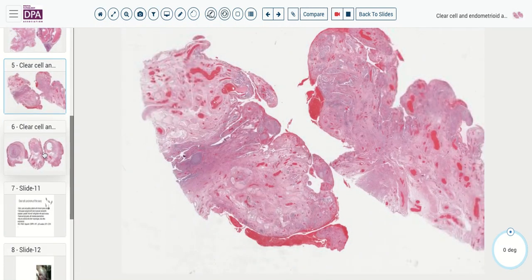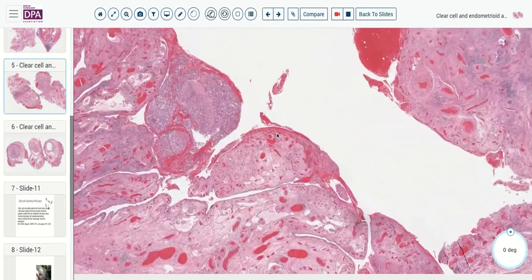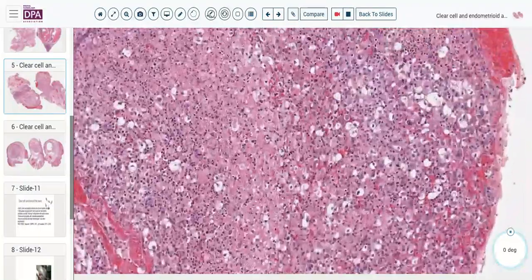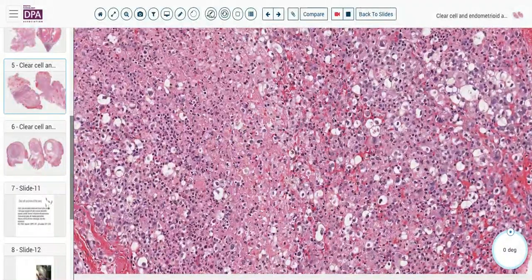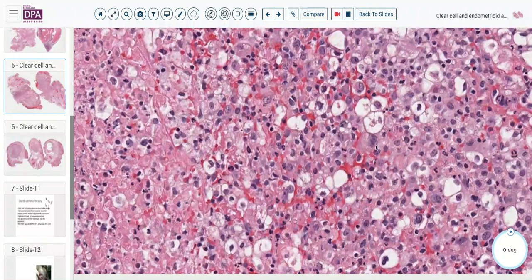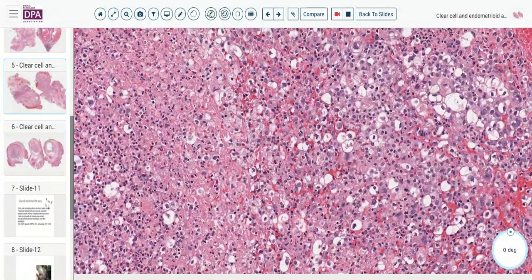Spread of the tumor into other locations, such as here to the fallopian tube, may produce a slightly different pattern. Here we see a solid pattern with sheets of cells, some areas of necrosis, and variable clear to pale eosinophilic cytoplasm. Nuclear pleomorphism is fairly remarkable — here's a quite large nucleus, another one, and then some smaller, less remarkable ones.